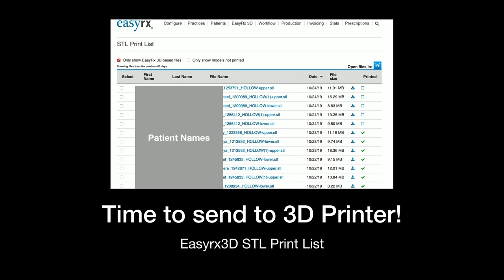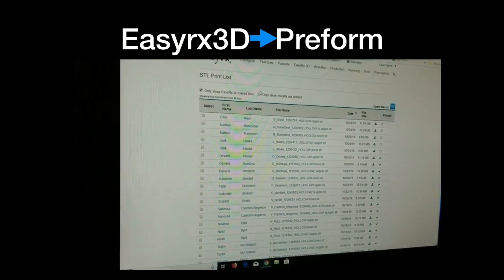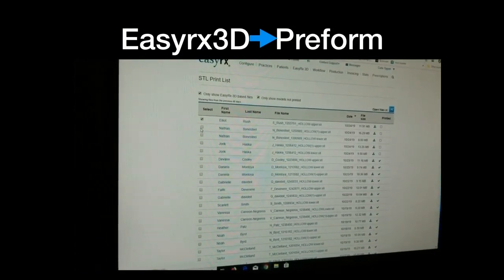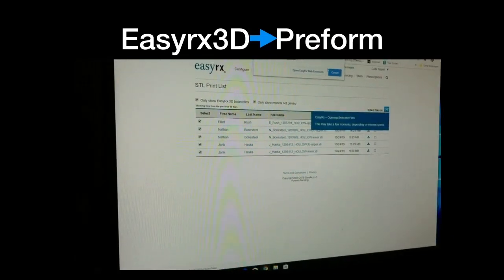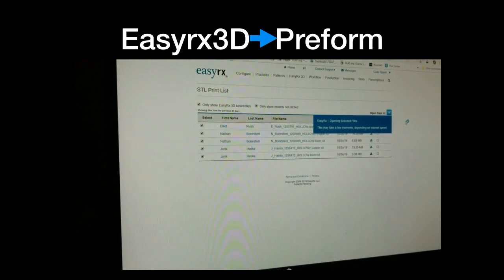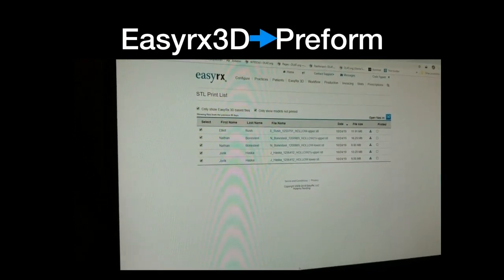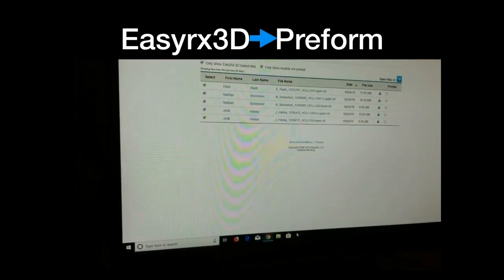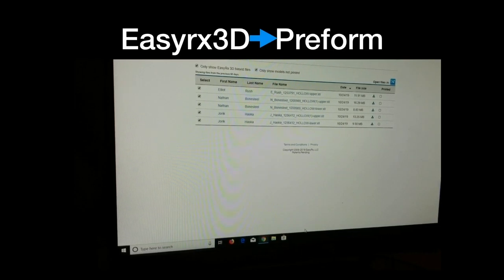and then you'll have a set of 5 or 6, and you just click all of those, and then click that button, and it opens my PreForm software that goes with my Form 2. So this is a video of me doing that. I couldn't capture it, so I'm actually holding a phone and trying to do this with a camera. So you can see I selected those models, and I was looking at the case pans while I was doing it, and I clicked that button right there. And remember, this is in the browser.